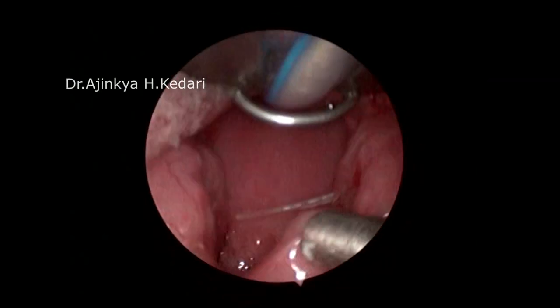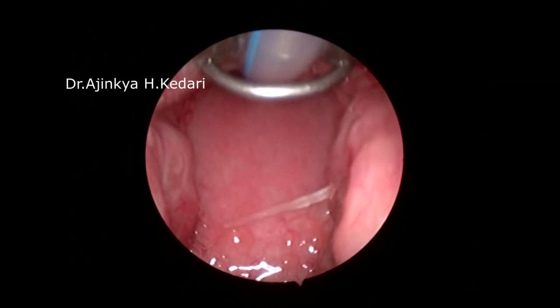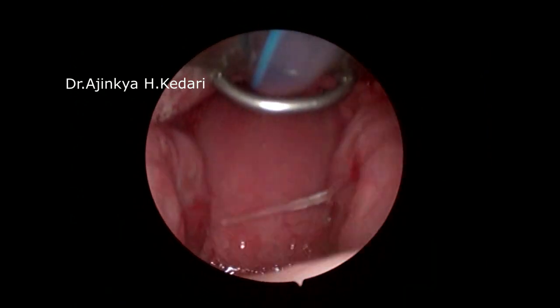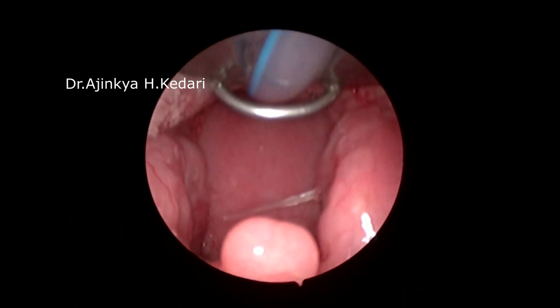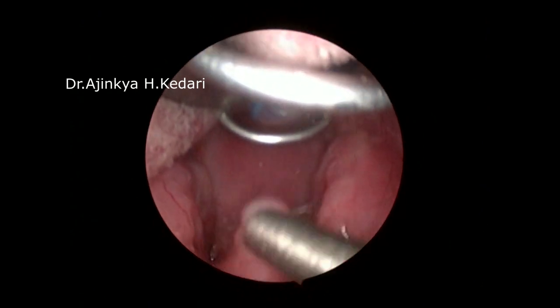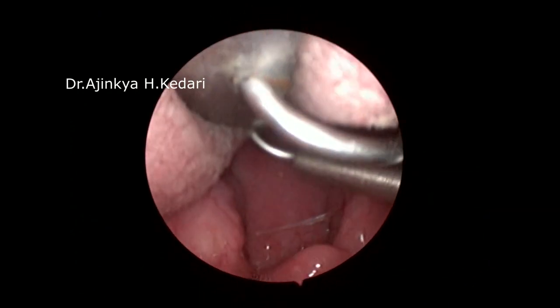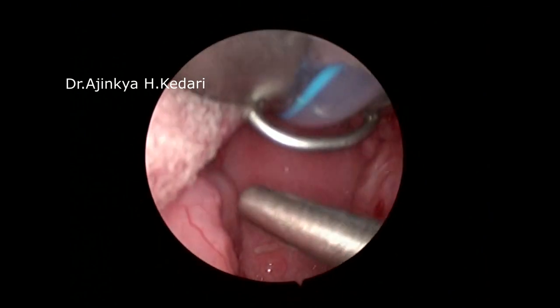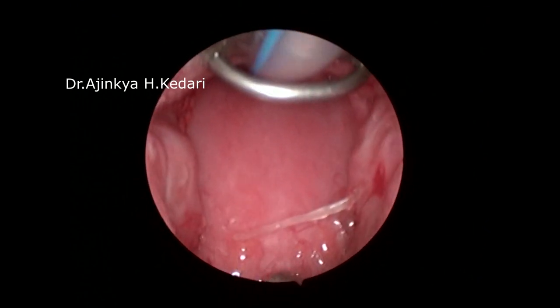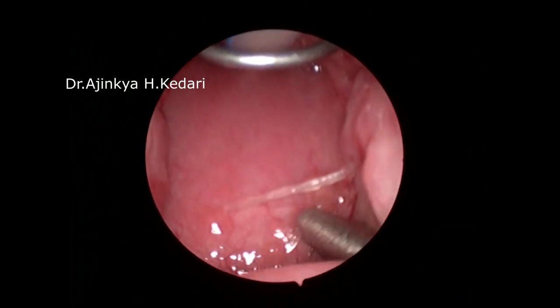This is a case of a foreign body fish bone in the right tonsil. This patient's parents came to me with a history of throat pain and excessive crying following ingestion of fish meat. The patient was being made to eat fish meat by his mother, following which the patient started crying and since then was having complaint of throat pain.